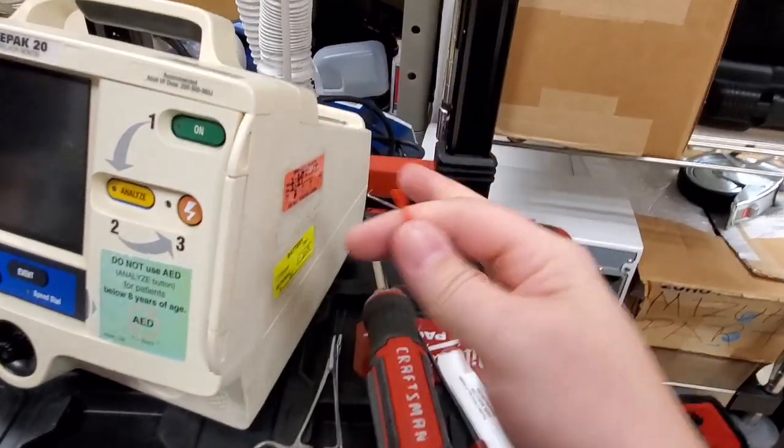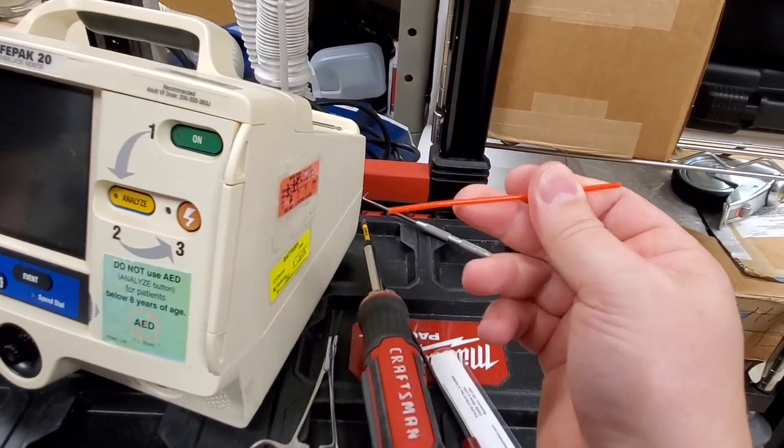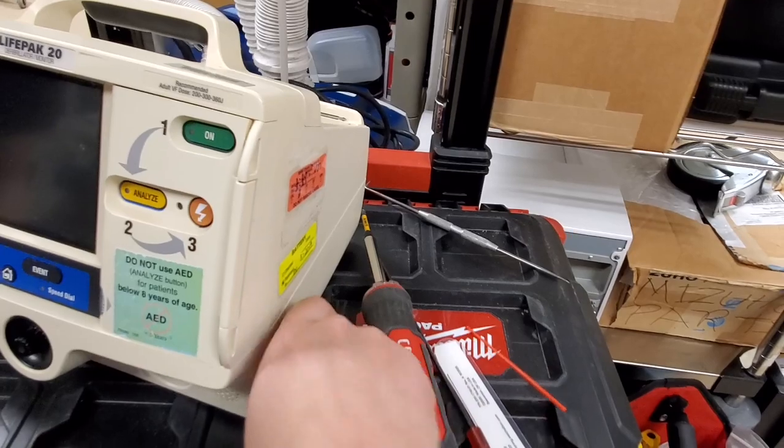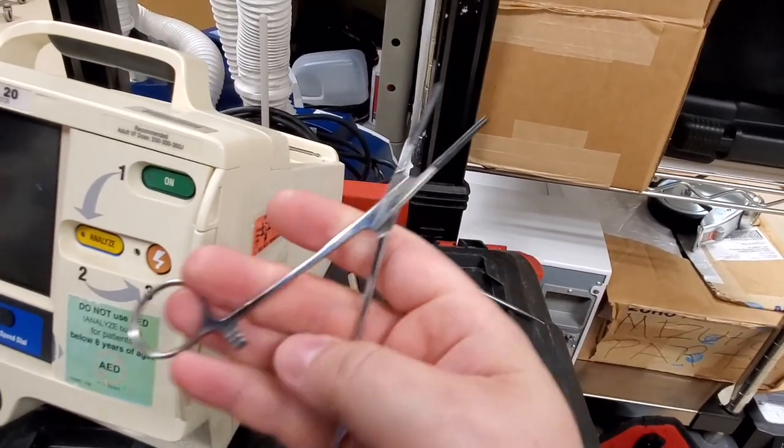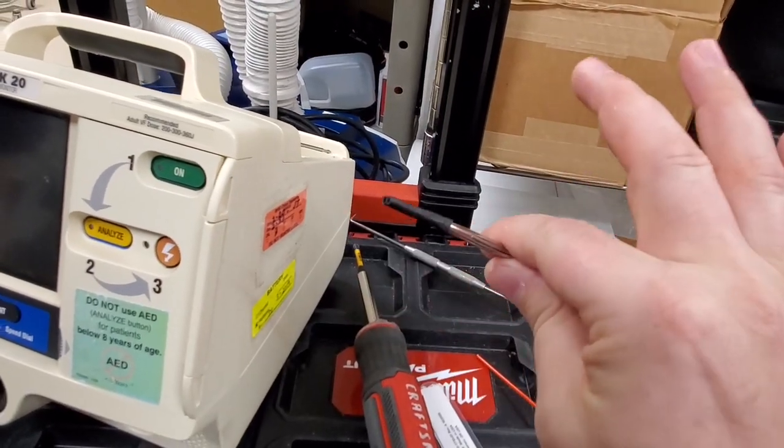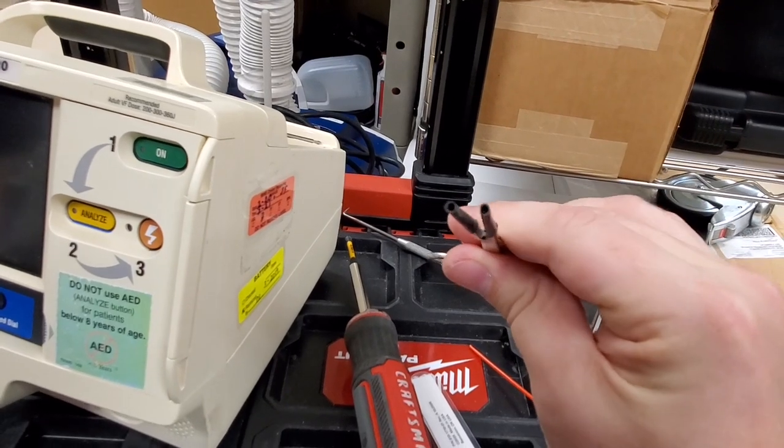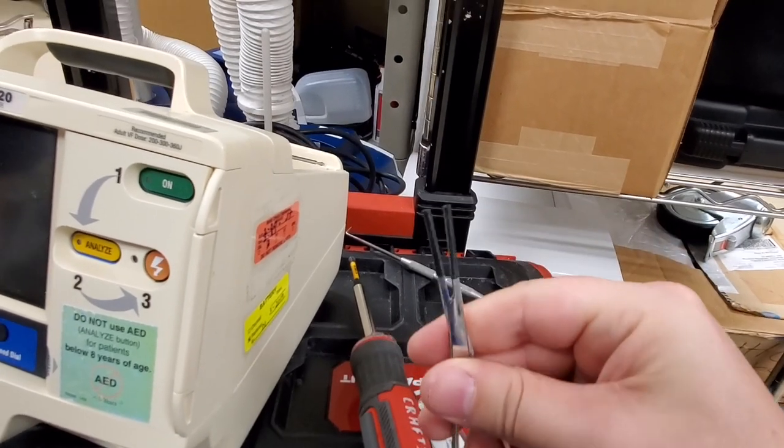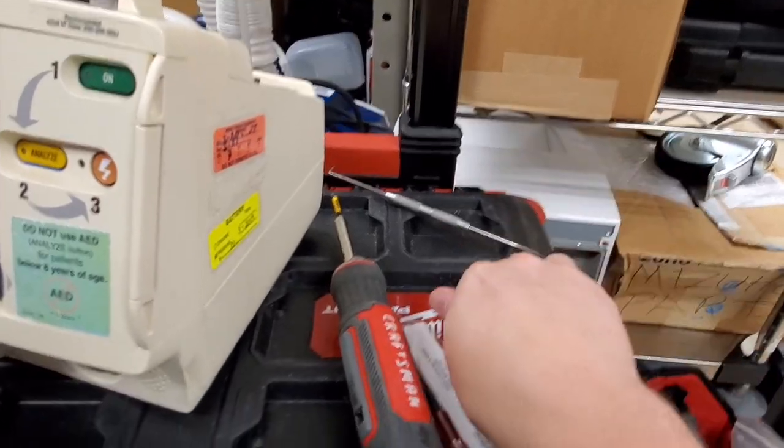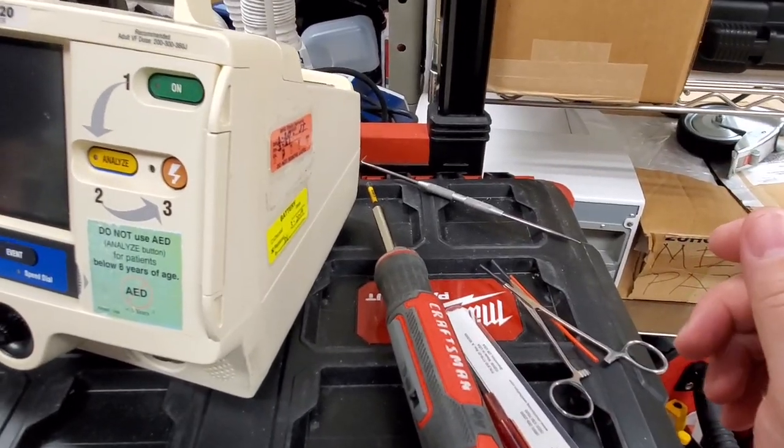Here you can see I got a set of forceps. They're really fine pointed and I also have some shrink tube around the tips. Alright, so let's get into it.